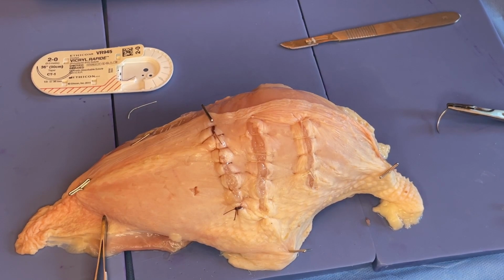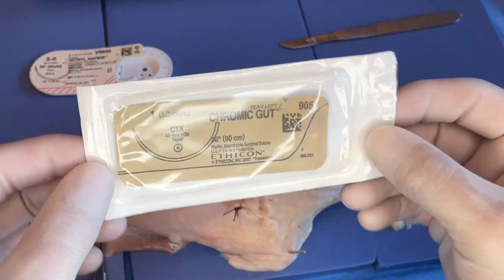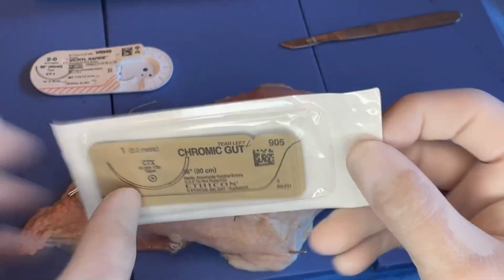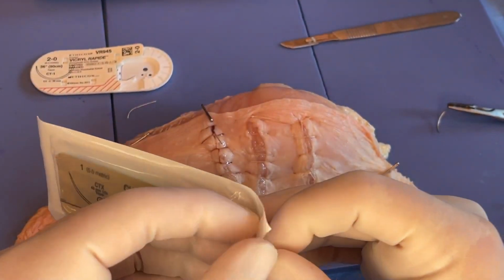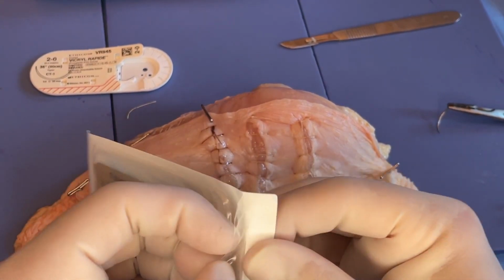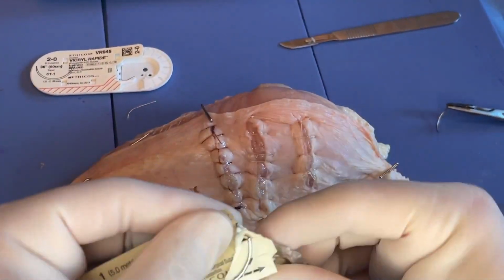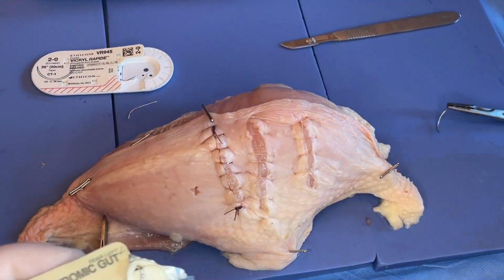All right, let's talk about figure of eight sutures. These are sutures that we place for focal hemostasis. We're going to switch it up a little bit with our suture. We've got a 1 chromic on a CTX needle. I tend to use a CTX for closing the fascia and for closing the uterus, not with chromic.